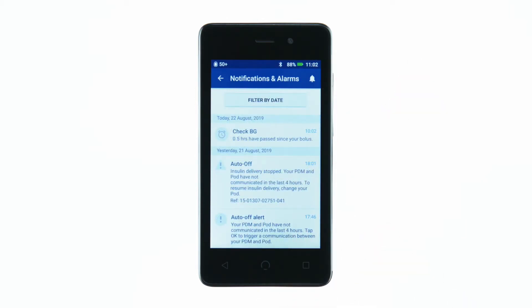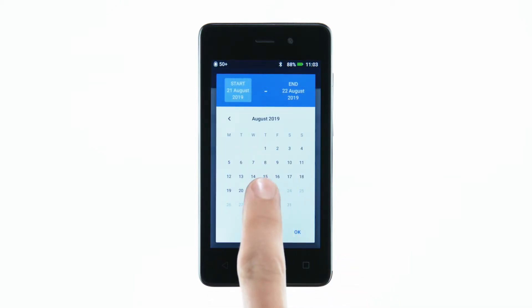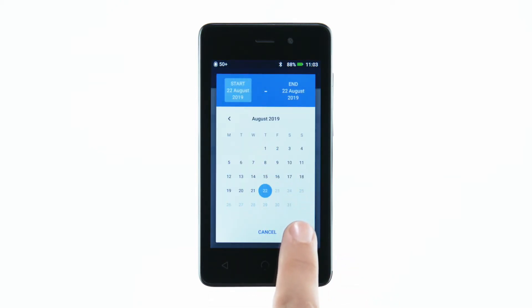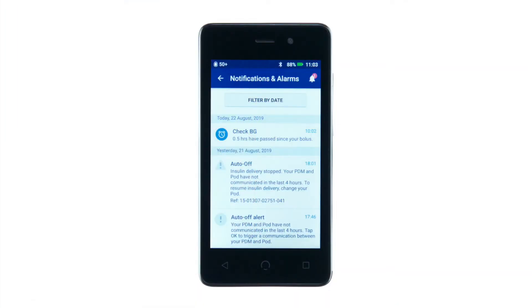You can look at a specific date range with the filter by date button. New notifications are represented by a blue icon, while ones that you have already viewed will show a grey icon.